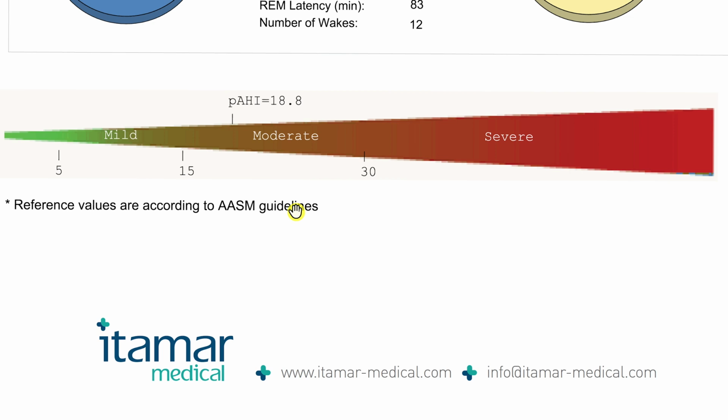And I'm going to reiterate, because it bears repeating, AHI and RDI are not a complete measurement of sleep disordered breathing. I have seen many patients with RDIs even less than 5 who are severely debilitated from their symptoms. And then they go on PAP and it's all resolved. So what does that say to you?